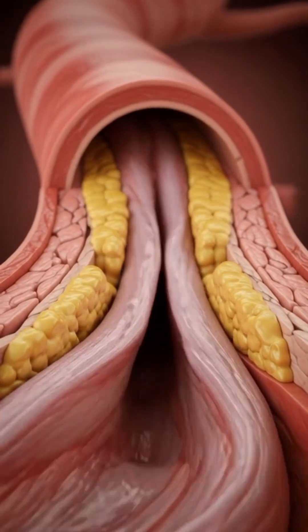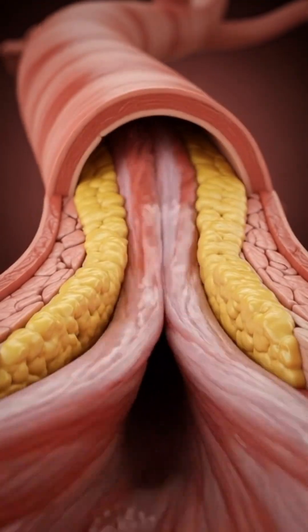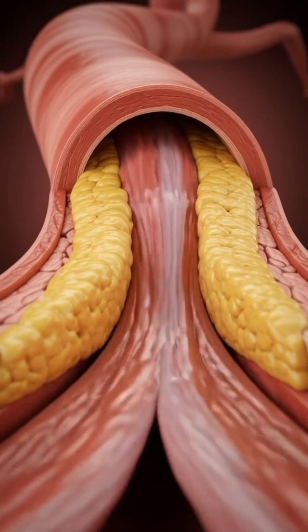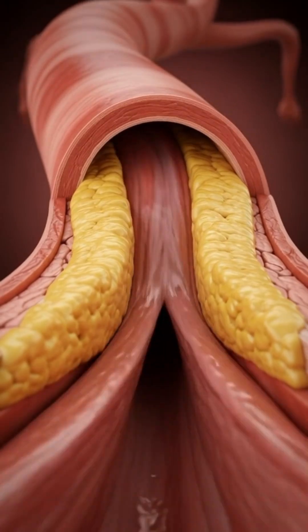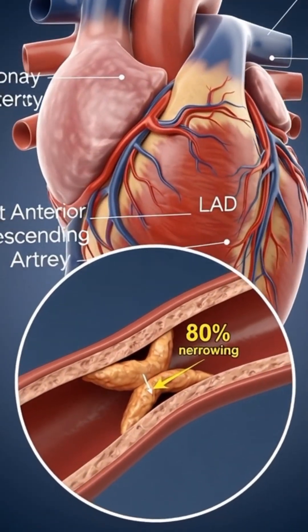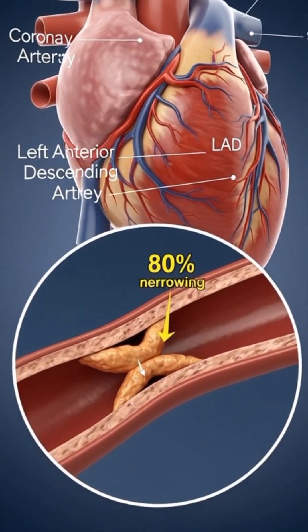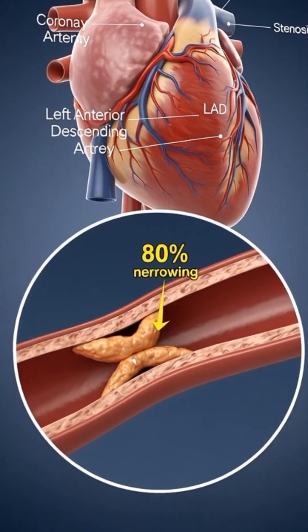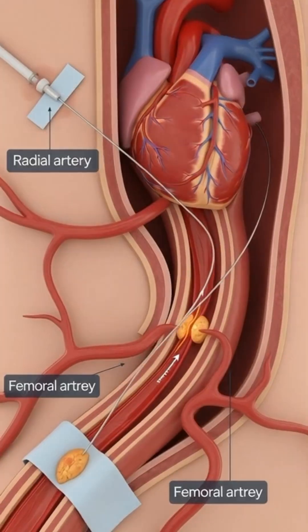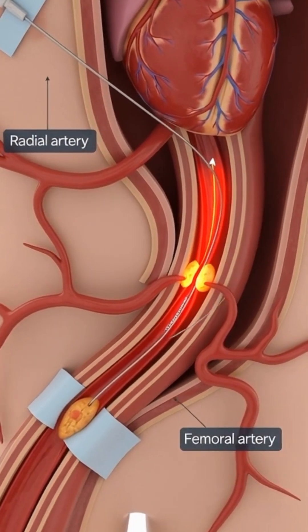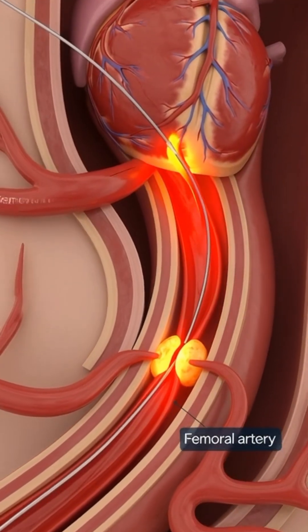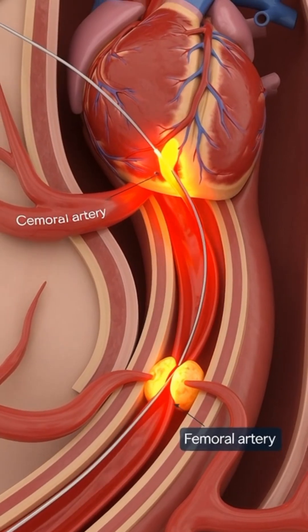When plaque builds up inside the artery, blood flow becomes narrow and restricted. When the blockage becomes dangerous, doctors perform angioplasty or place a stent. A thin catheter is guided through the blood vessel toward the blocked artery.